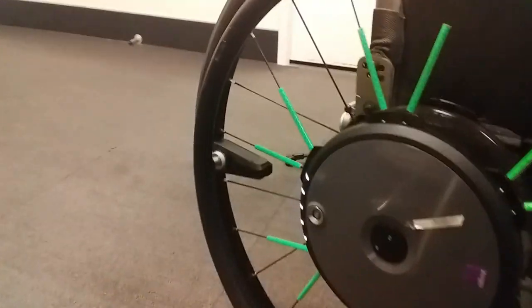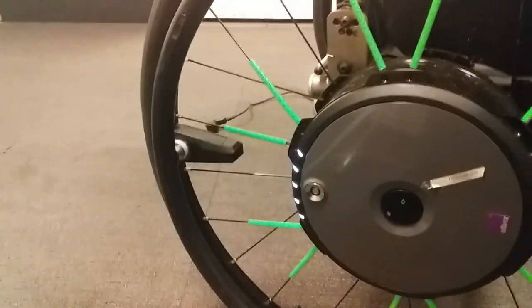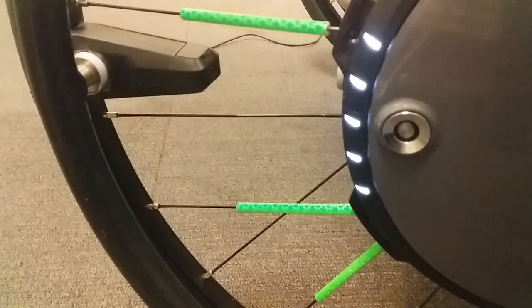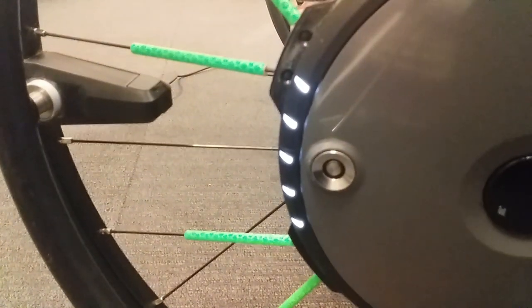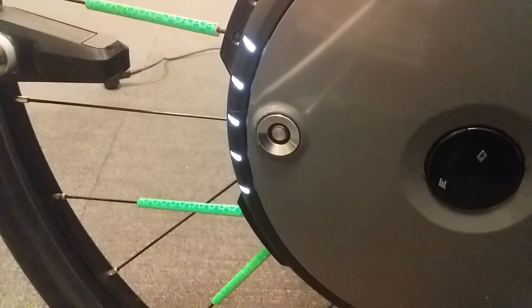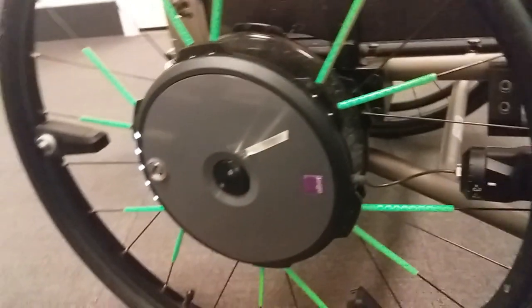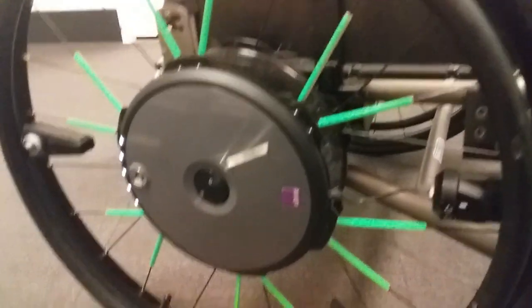It's got five lights on the front — I didn't notice that at first, I thought it was four. That indicates how much battery you have in it. And there's a charger there — it's a magnetic one including a button so you can turn it off.